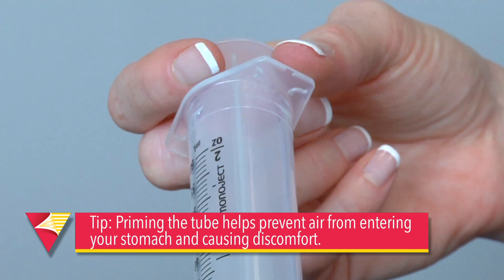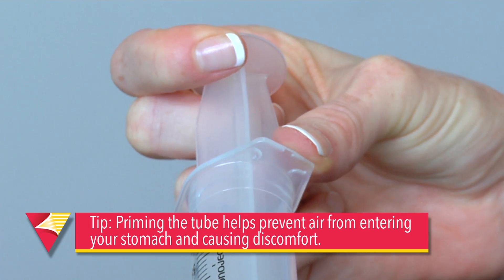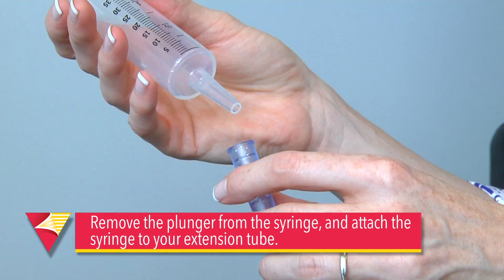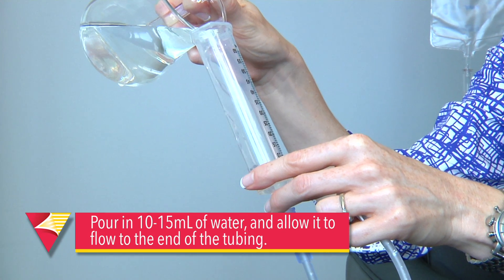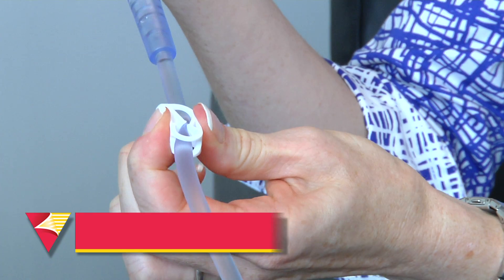Priming the extension set removes any air that could otherwise enter your stomach and cause discomfort. The first thing you'll do is remove the plunger from the syringe and attach the syringe to your extension tube. Pour in 10 to 15 milliliters of water and allow it to flow just to the end of the tubing. Next, clamp the extension tubing.